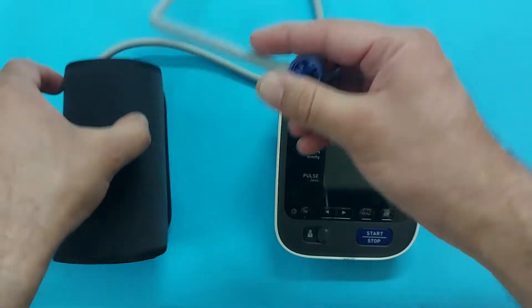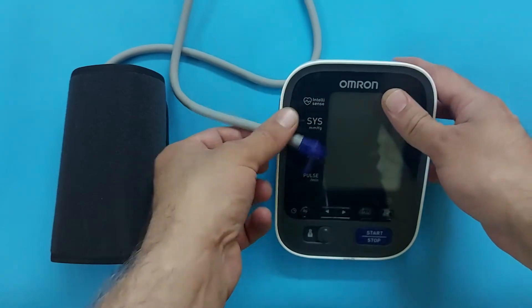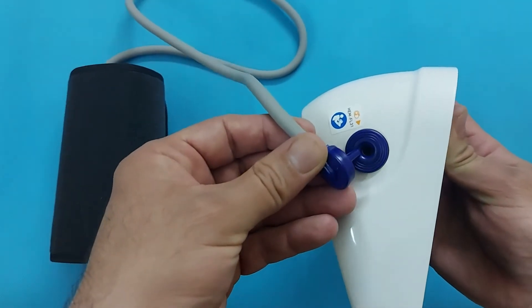Now we will connect the arm cuff to the Omron M7. As you can see, insert the tube head here.